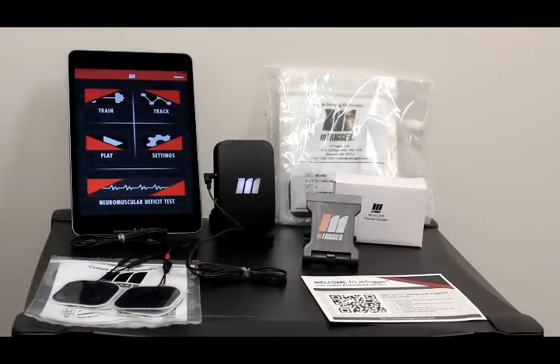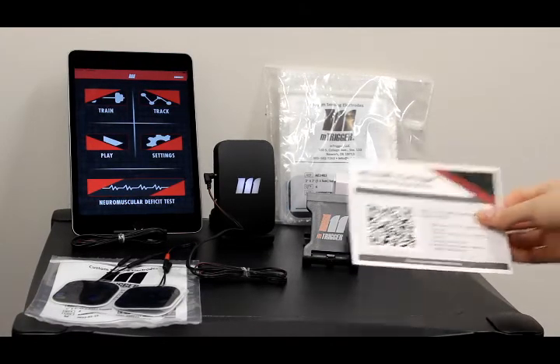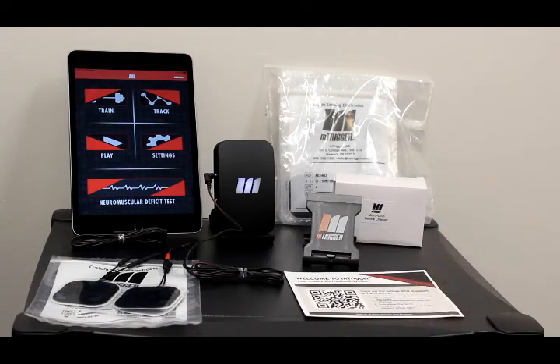And you're ready to go. Grab a phone or tablet and ensure that you've completed the basic setup steps outlined on your welcome insert as well as on this page of the website. Power your mTrigger on, download the app, and establish your Bluetooth connection. Then proceed to the app navigation series to familiarize yourself with mTrigger's settings and features.